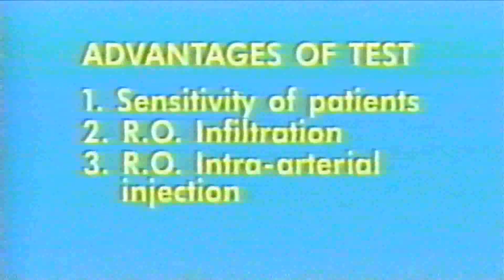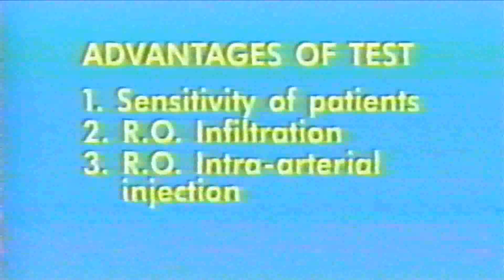If thiopental is to be used, a test dose, which would be 50 milligram, 2 cc, is injected intravenously. The advantage of test dose is to check sensitivity of the patient and to make sure that there is no infiltration intravenously, and make sure there is no intra-arterial injection, although it is rare, but if it occurs, complication is very severe.